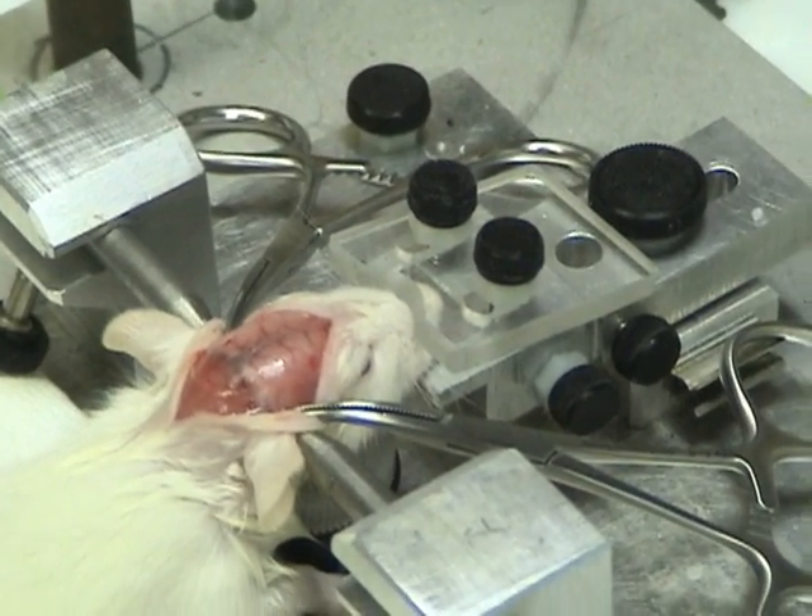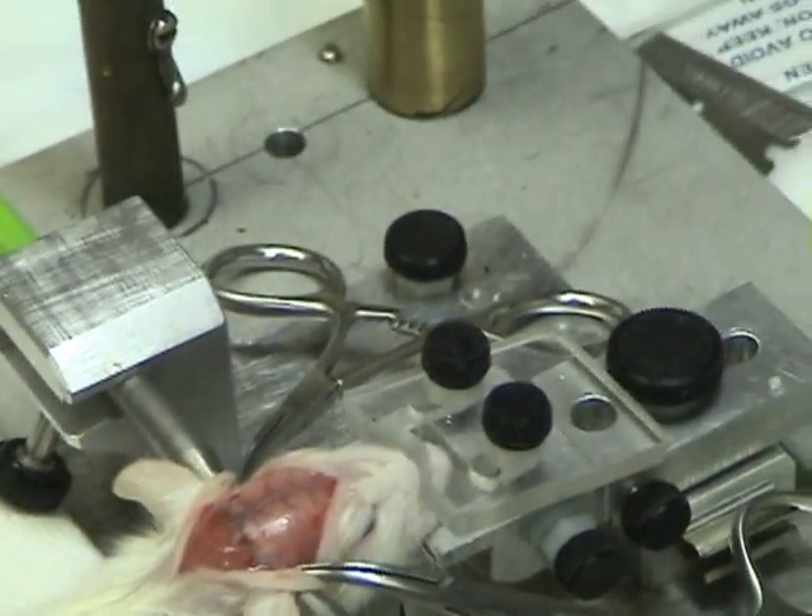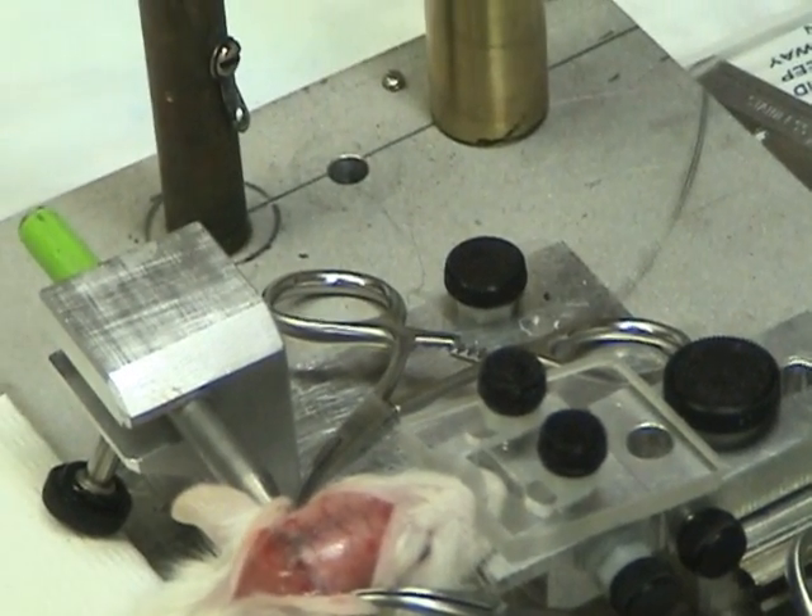In our case, I'm going to put six electrodes. Six? Yeah. But we don't need all of them — I need only three, actually.